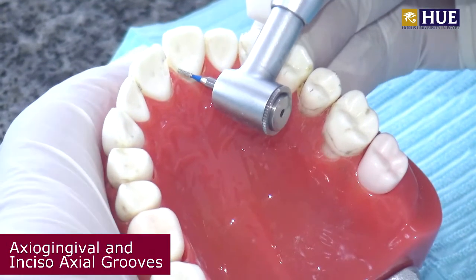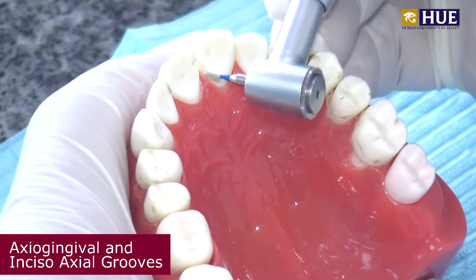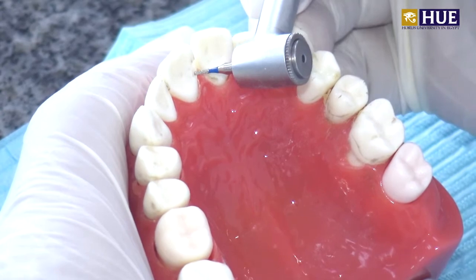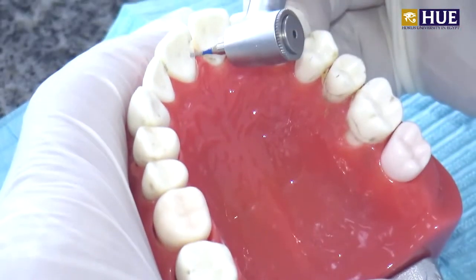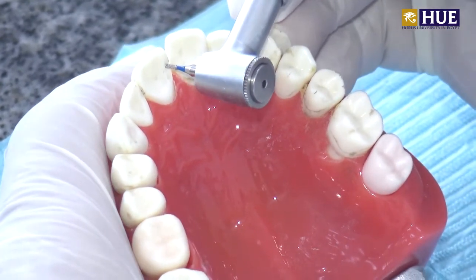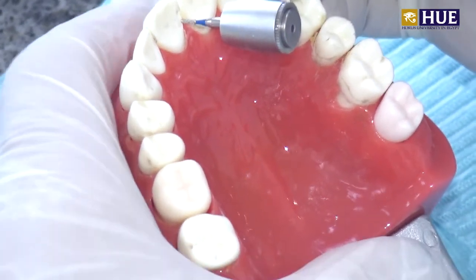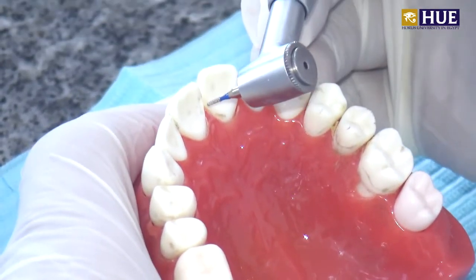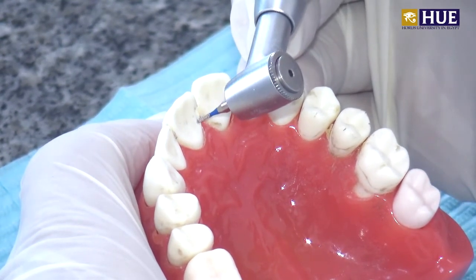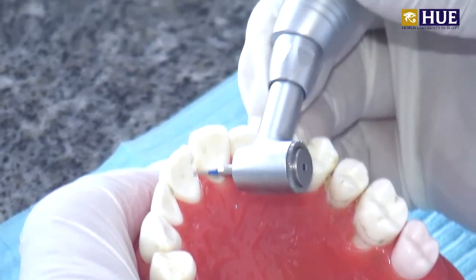In a large conventional class 3 GV Black cavity, we have to establish axiogingival grooves in this line angle, and incisoaxial grooves at the incisal, using a fissure bur of very small size, or round bur number 0, at the axiogingival line angle and at the incisoaxial line angle.